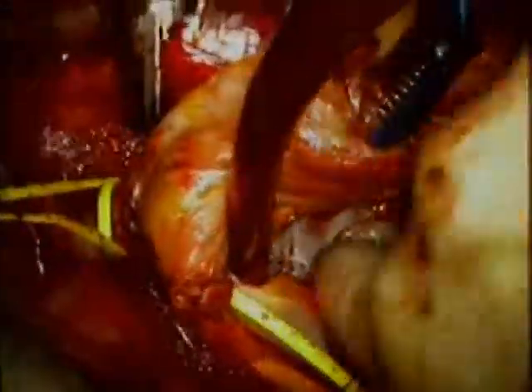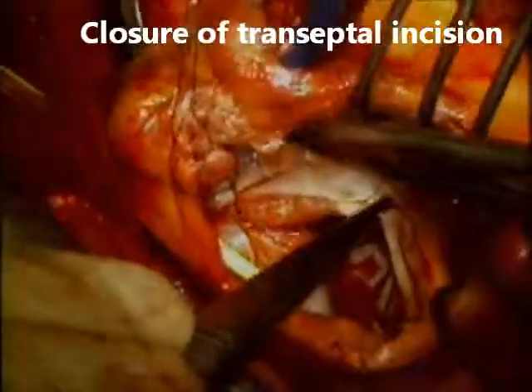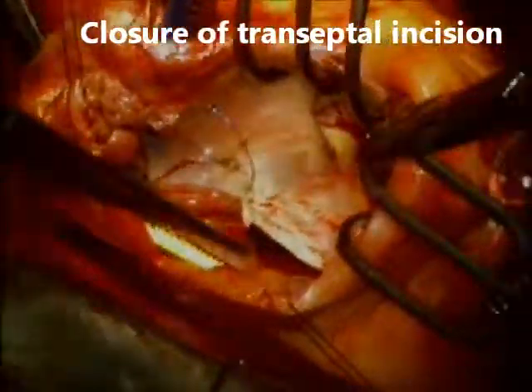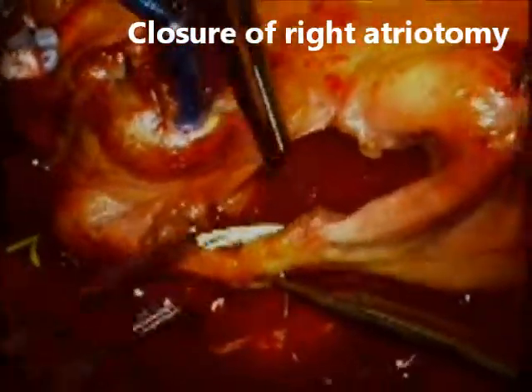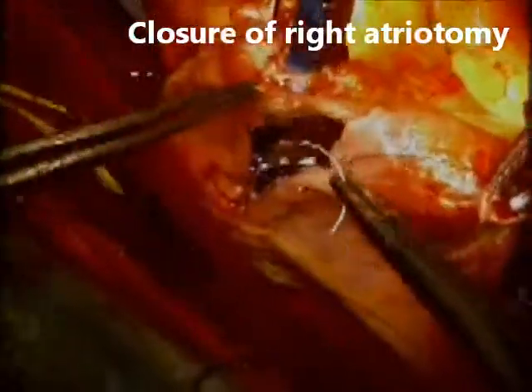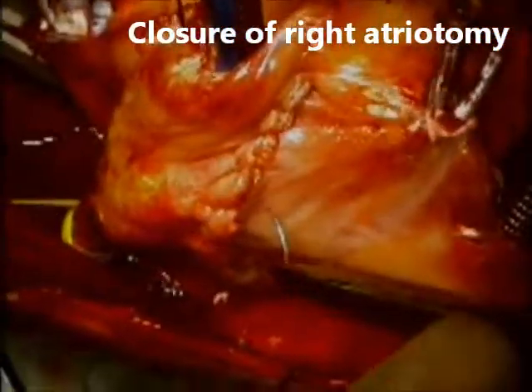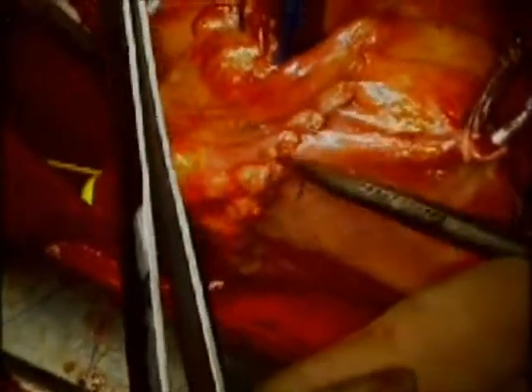Once this portion of the operation is completed, we proceed with closure of the transeptal incision. That portion of the transeptal incision tends to be sometimes pretty thick, so it is helpful to use an SH needle with 4-0 polypropylene for closure. The same suture material and needle size is used to close the right atriotomy, and as you can see, I proceed with a second layer — a second suture line going in between the bites of the first suture line.